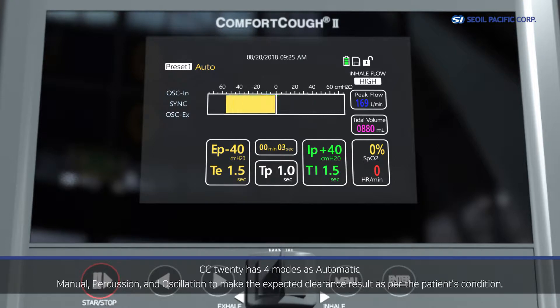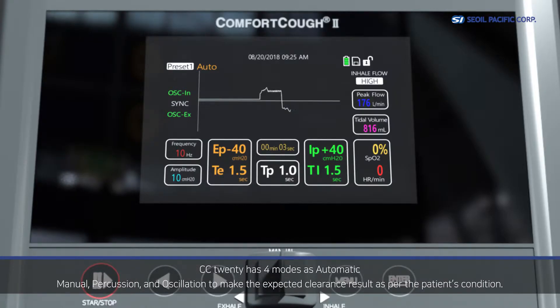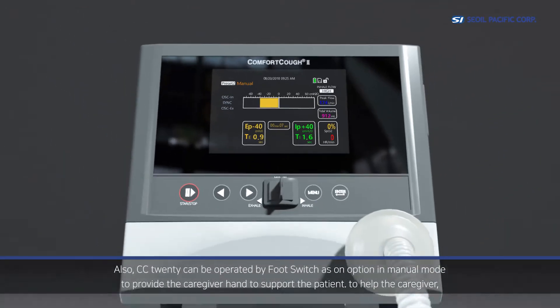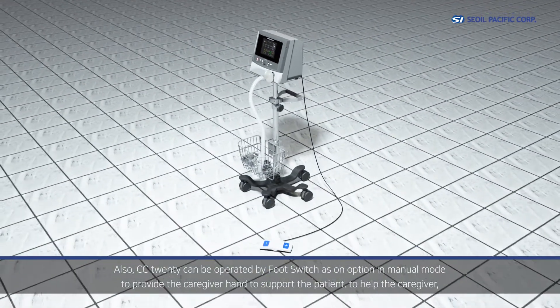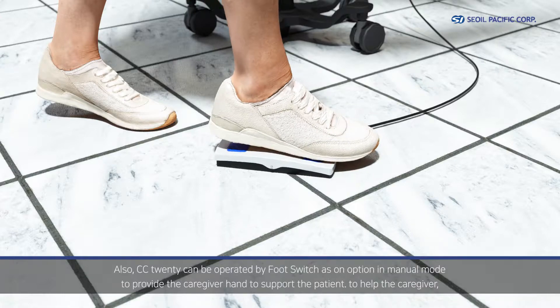CC20 has four modes: automatic, percussion, oscillation, and manual, to achieve the expected clearance results according to the patient's condition. CC20 can also be operated by a foot switch as an option in manual mode, to provide the caregiver a free hand to support the patient.